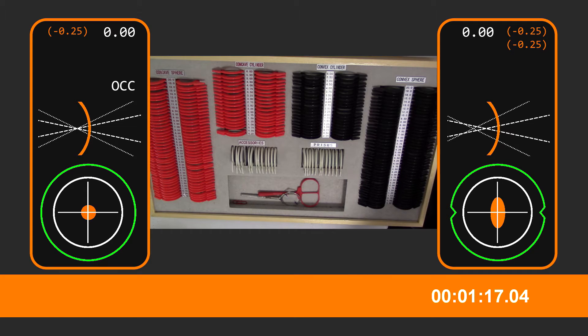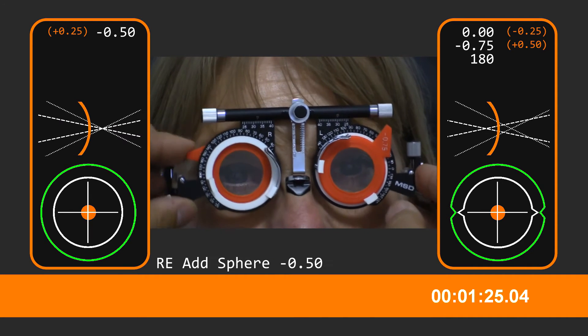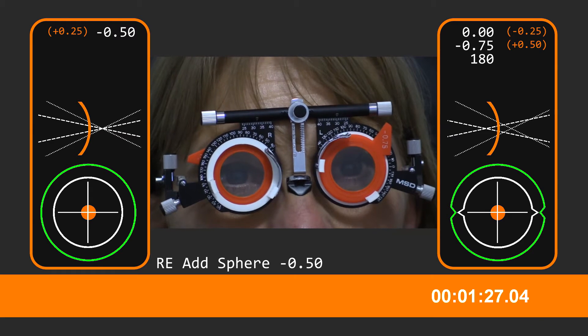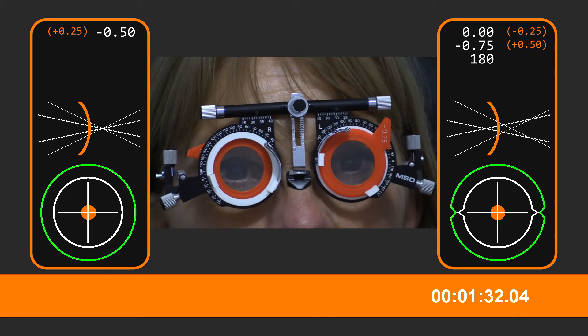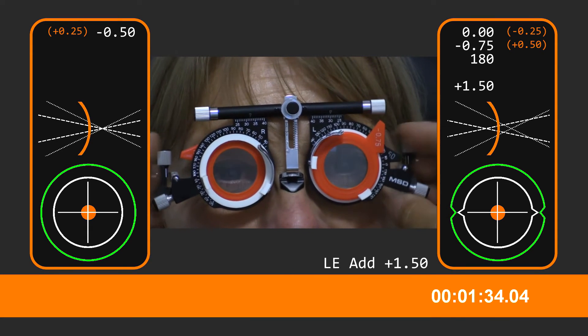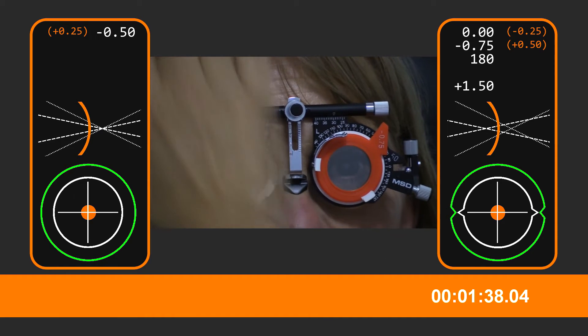I'll just start off what we had before, just as a nice, easy start. I'm lazy. Now, let's have a look. It's like a miracle. Oh. So, is that a bit blurry? Yeah, it's very blurry.